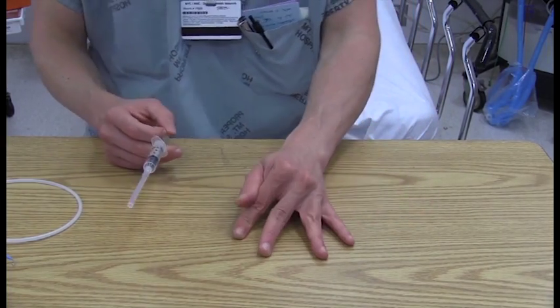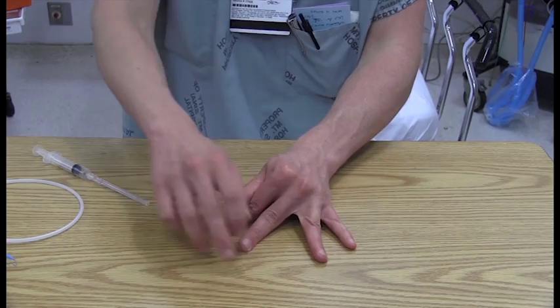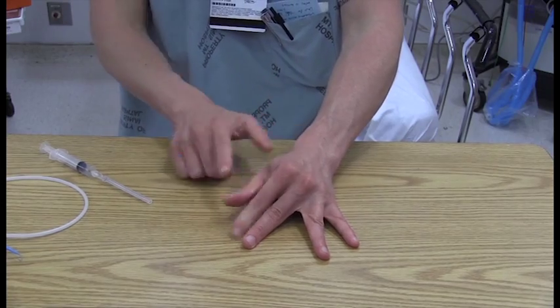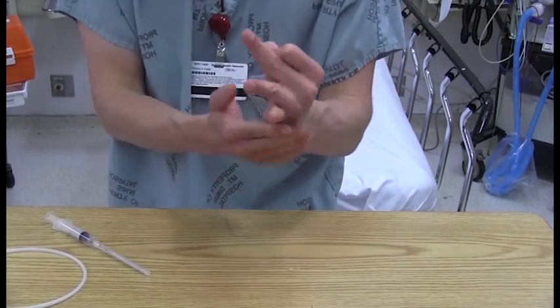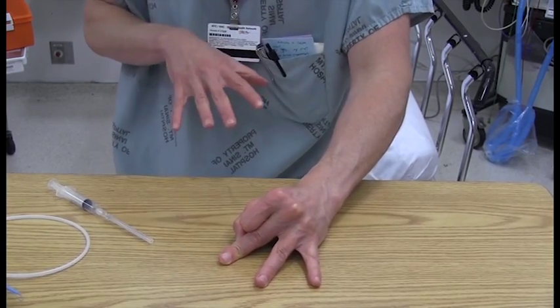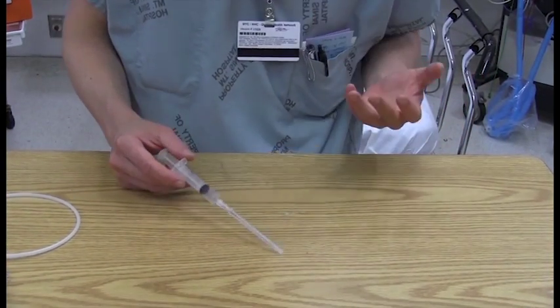So very similar to the bridge you use when playing pool, you want it as maximally stable as possible. When you look at a good pool player, they're always going to have as much of the hand in contact with the felt as possible, because that's going to give them the most stable bridge. Whether they have an open bridge or a closed bridge, you'll always see that their entire hypothenar eminence is touching the table, and that these three fingers are spread as far as possible to give you a beautiful tripod. Open bridge, closed bridge, it's the same thing for central line needle stabilization.